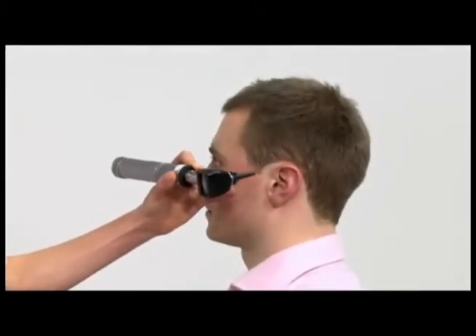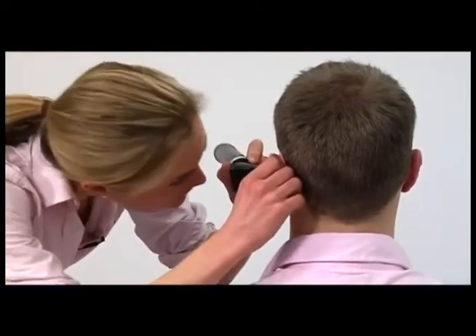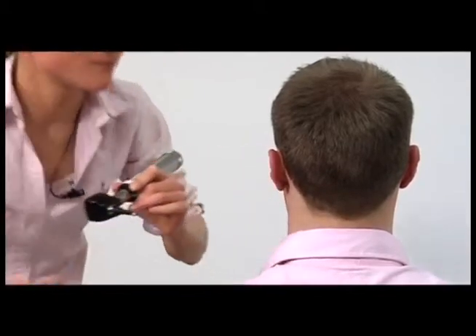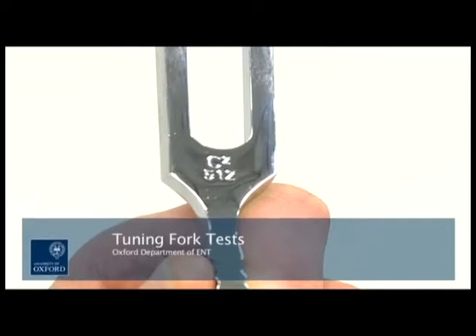When examining the left ear, hold the otoscope in your left hand, again holding it like a pen between your thumb and index finger, and using your little finger to rest against the patient's cheek. To complete the examination of the ear, the patient's hearing should also be assessed using the tuning fork tests and audiometry. The tuning fork tests are useful in assessing hearing loss.